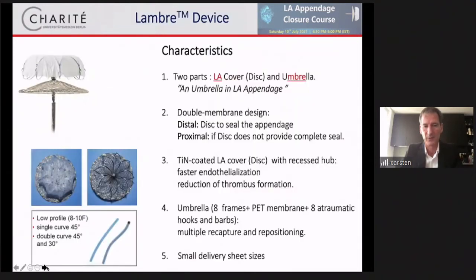So the characteristics, it's a disc type device. You have two parts, the disc and the umbrella, and it is really atraumatic.